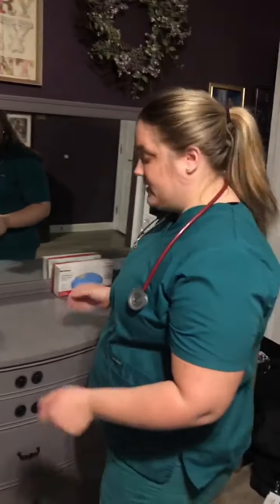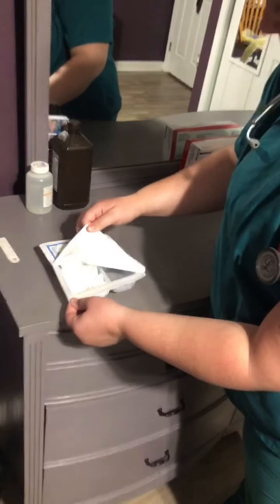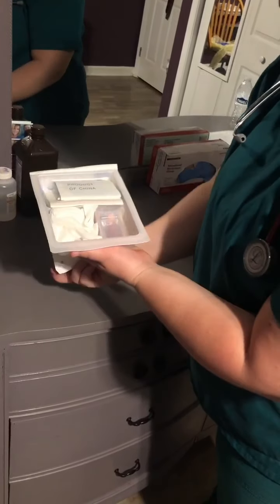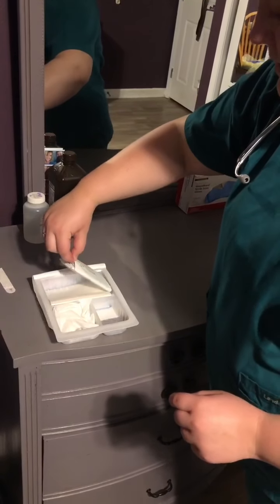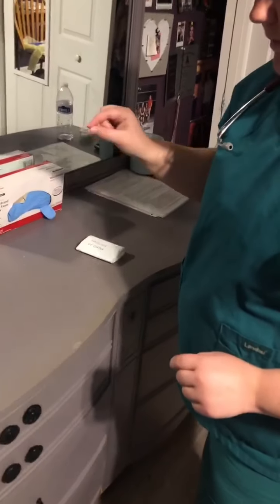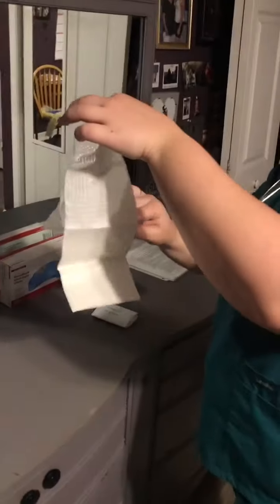So I'm going to get my supplies ready here. So take this. Be careful not to touch the inside. I'm bending that back. So I'm going to take my sterile gloves out, not touching anything, placing them over here. And then I'm going to take my sterile drape and place that down, making sure I'm not touching the inside.